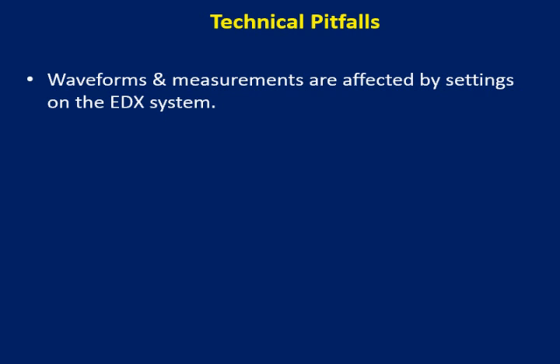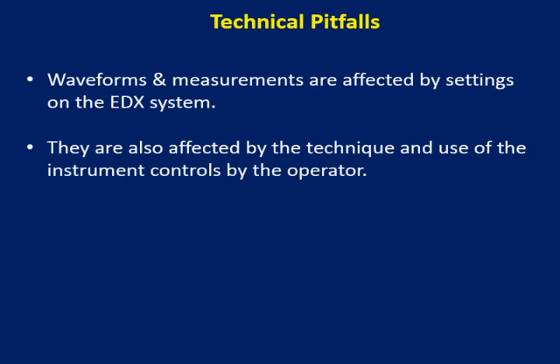We have discussed how waveforms and measurements are affected by settings of different components on the electromyograph. They are also affected by the technique and use of instrument controls made by the operator. Deviation from the standard testing protocols can lead to pitfalls in electrodiagnostic studies.